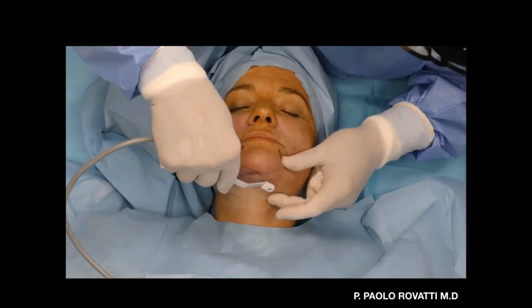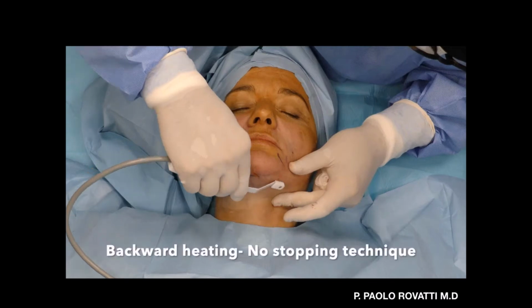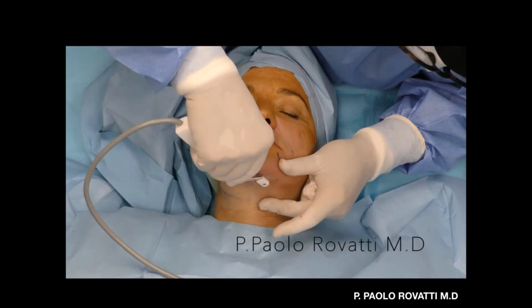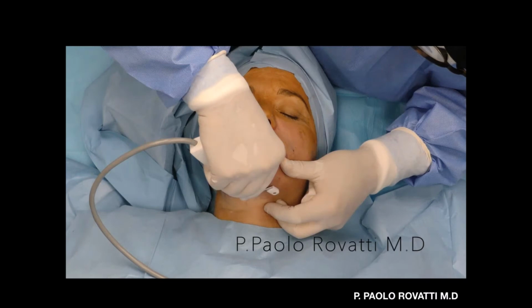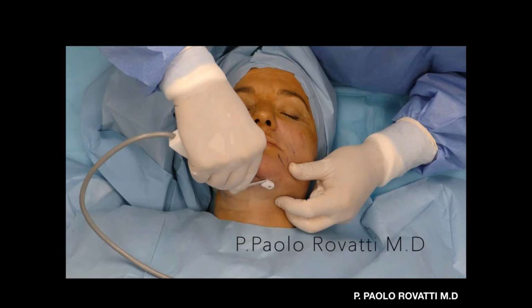And now I'm starting. I'm treating and I'm going backward. And now I'm not doing the stopping technique. After, I will show you. The stopping technique is just for sometimes when you need to fix and to create a contraction in some gravity points. But now, in the neck, it's really very, very thin skin and not so much thickness. So what I'm doing is going backward very slowly and treating. Don't go too fast. I see many doctors doing it fast. This is not liposuction. I need to have time to release heat on this setup.